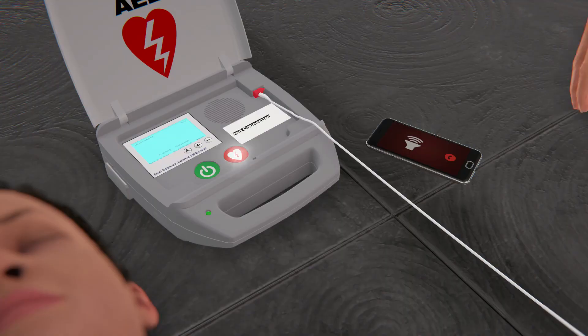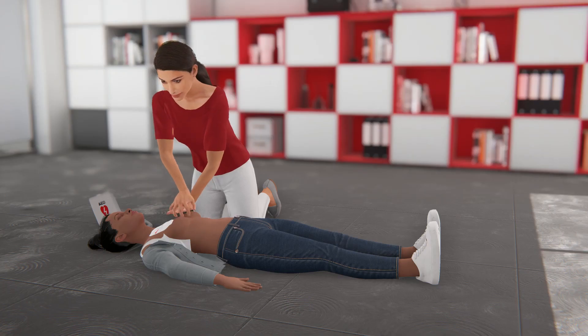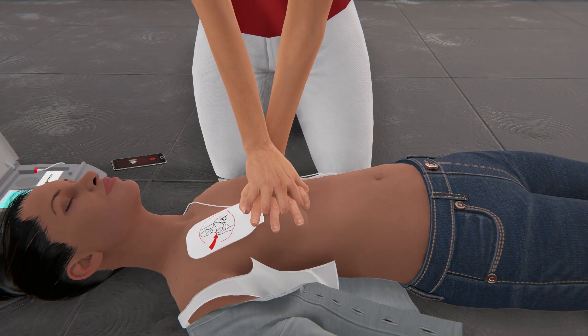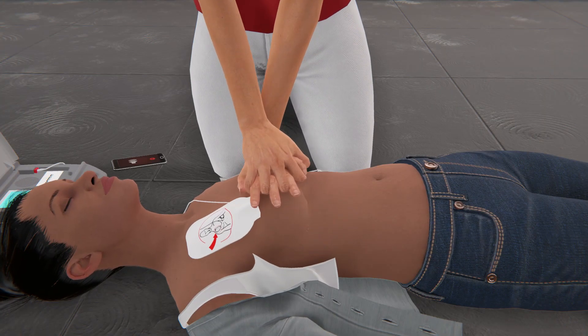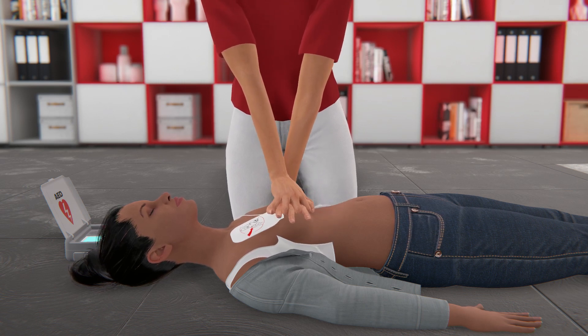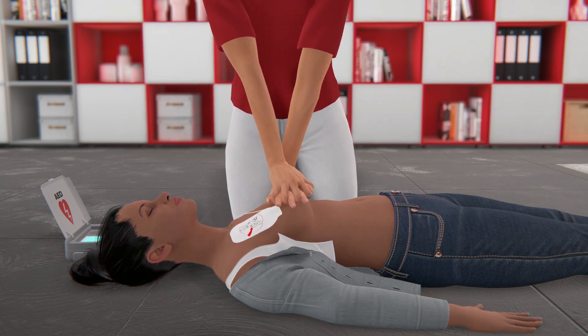You will likely need to repeat several cycles of compressions and shocks. Follow the prompts from your AED to begin CPR and start with compressions. Try not to interrupt compressions for more than 10 seconds, and follow the prompts from the AED until help arrives.